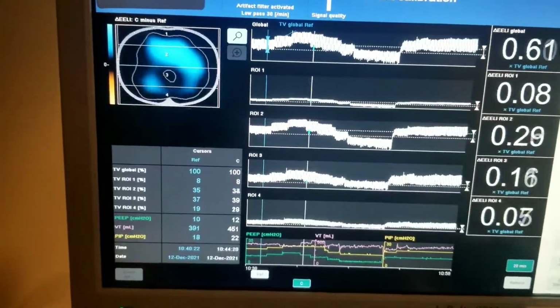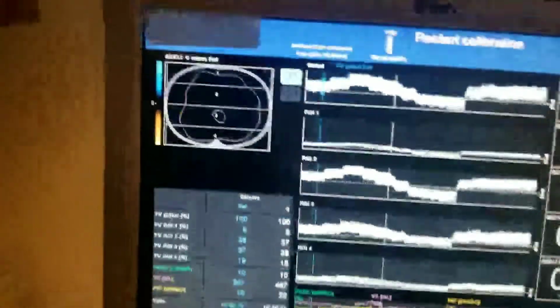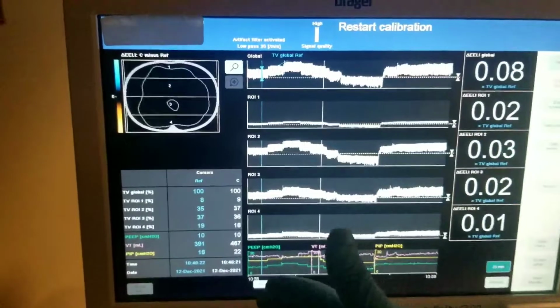And we went back down. Here you'll probably see a loss starting at 12, okay, 10 and 10, no change. Kind of makes sense because you're comparing 10 to 10.